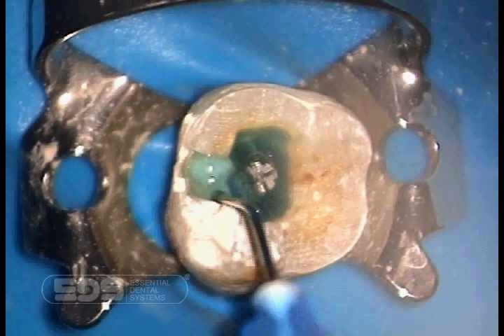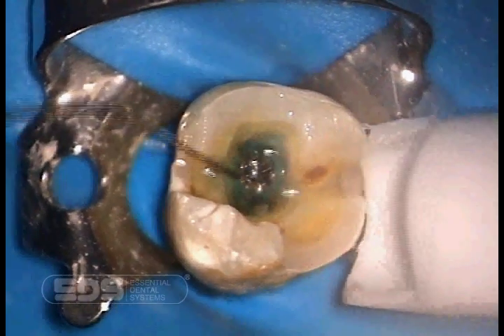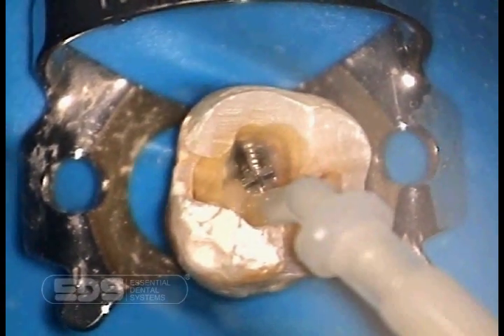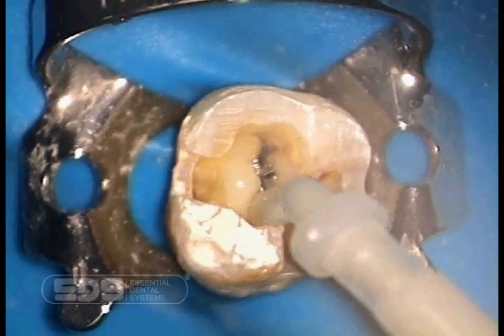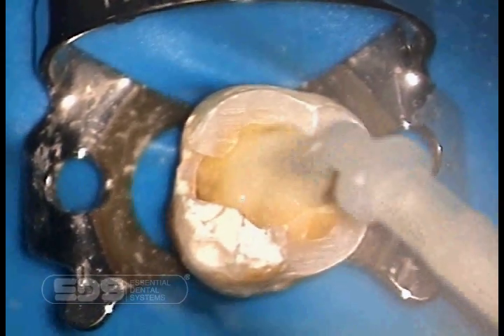In preparation for the core, we are etching all the internal dentinal surfaces. We now wash off the etching agent. We place Tycor Auto-E, which is a self-mixing, dual cured, reinforced composite as the core material. Tycor has a proven 10-year fluoride release. This will be bonded to the etched surface which has just been created.